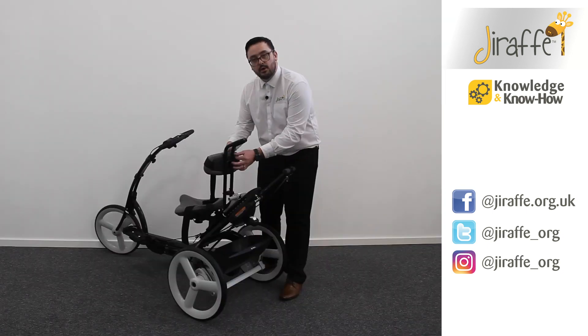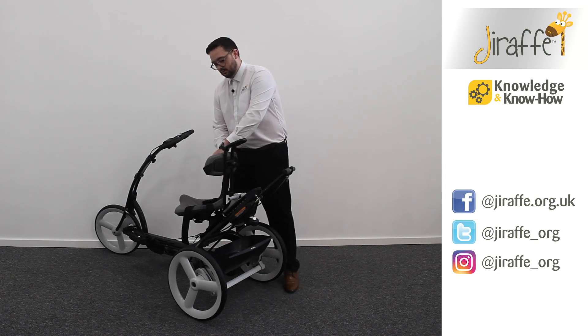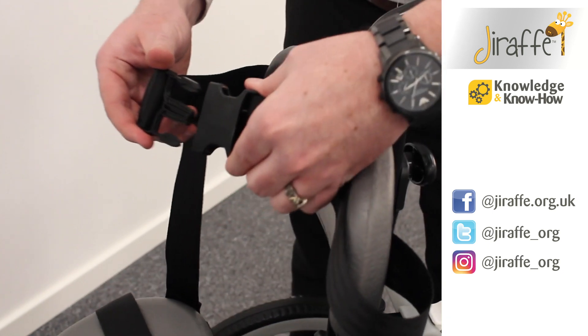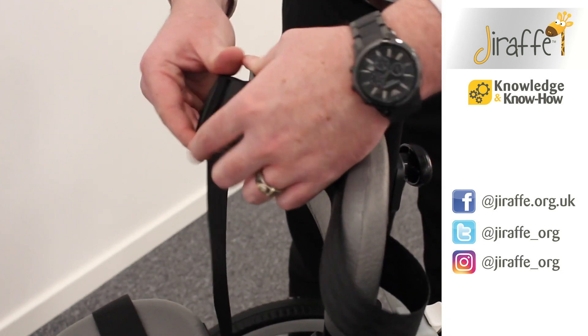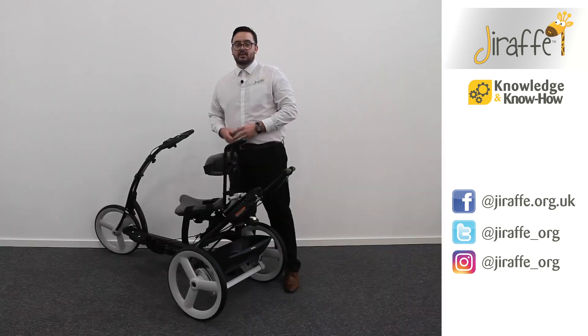The backrest pad also comes with a simple belt strap that we can secure around the user's trunk. Unclip the belt, wrap around the user, clip back into place, and then pull the webbing taut as needed for appropriate positioning.